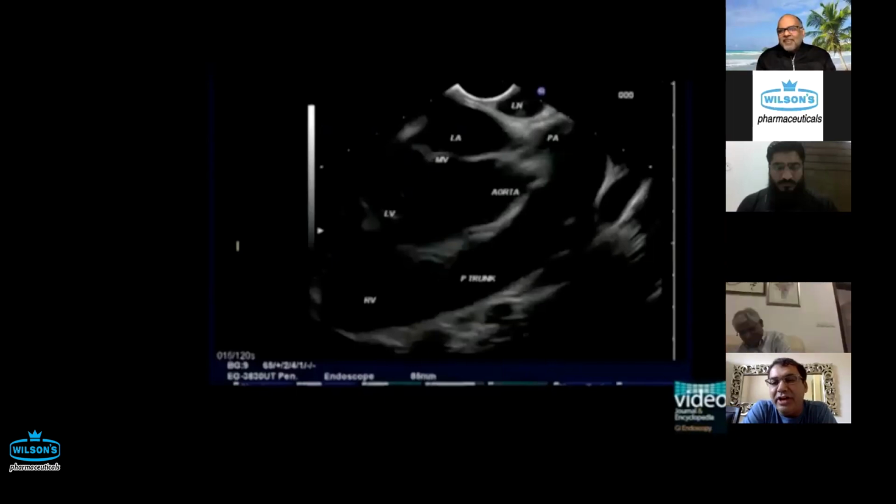I'm always intrigued when you explain the vascular anatomy in the mediastinum. I'll just summarize Amjad bhai's talk in a minute, for those who are starting or still at an intermediate level for EUS of the mediastinum.